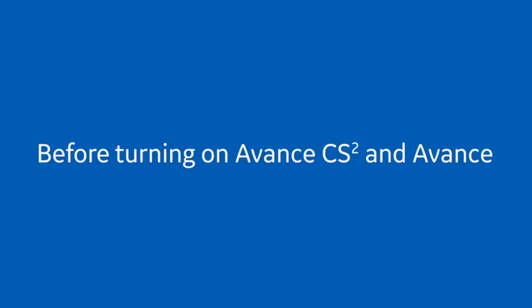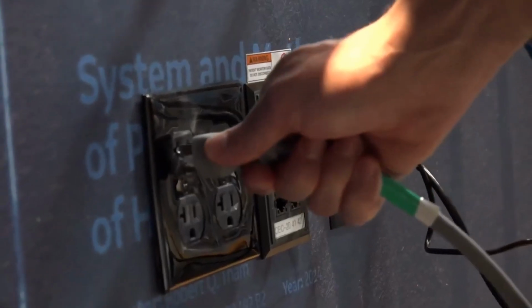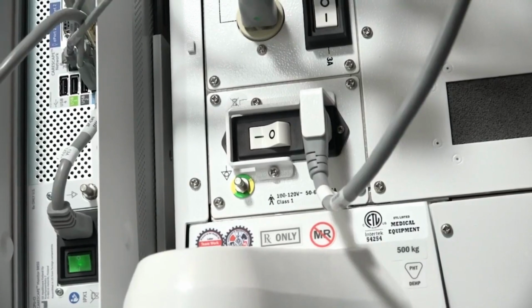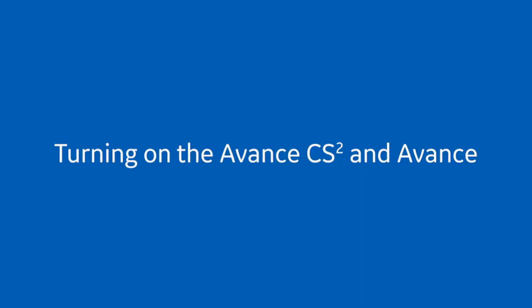For the Avance CS2 and Avance, connect the gas supply hoses to the wall gas source or turn on the gas cylinders. Plug the power cord into an electrical outlet. Make sure the system circuit breaker, located in the lower back, is switched in the on position.